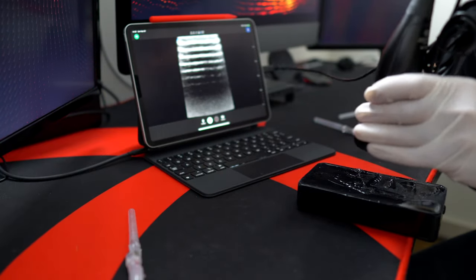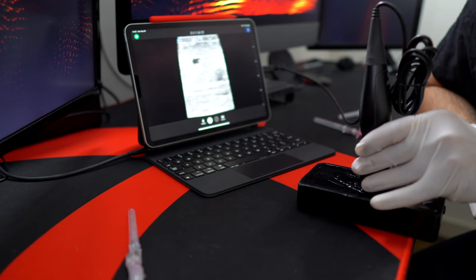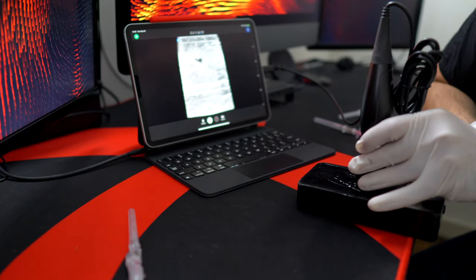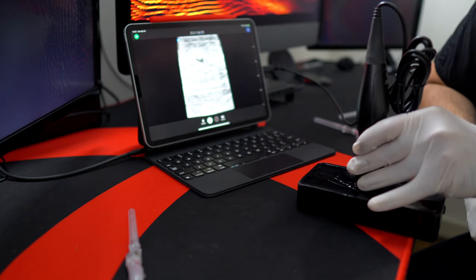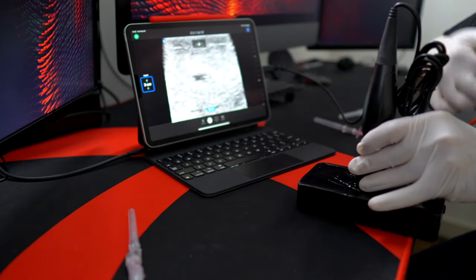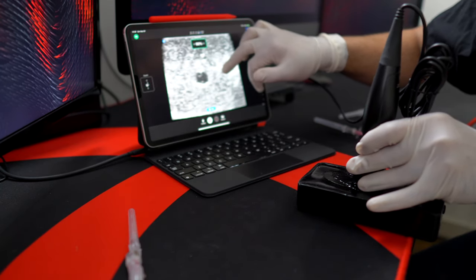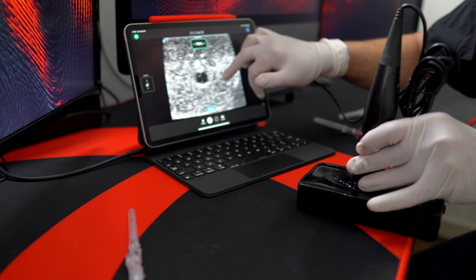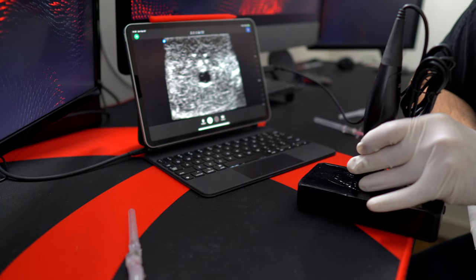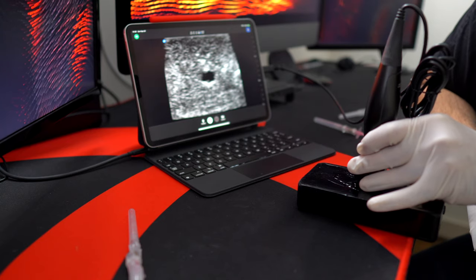The first thing we're going to do is take our ultrasound probe and adjust our knobology — meaning our gain, our depth, and all those basic settings. My target of interest is this vein right here, but it's a lot shallower than the current depth of field. So I'm going to decrease the ultrasound depth to optimize resolution. I'm also going to drop the overall gain. Ideally blood will appear black and surrounding tissues will have varying levels of gray depending on whether it's muscle, nerves, edema, and so on.